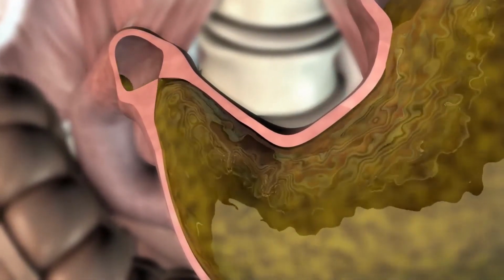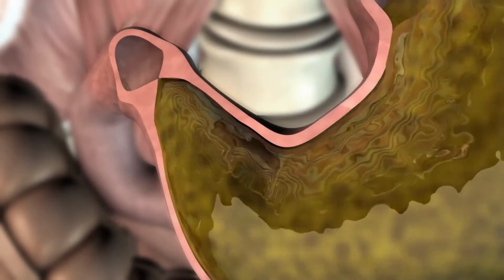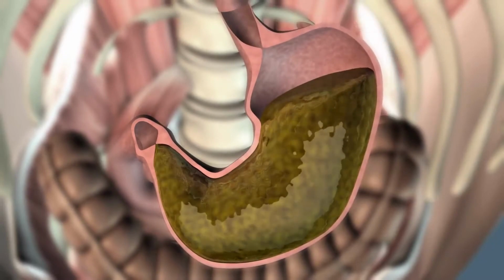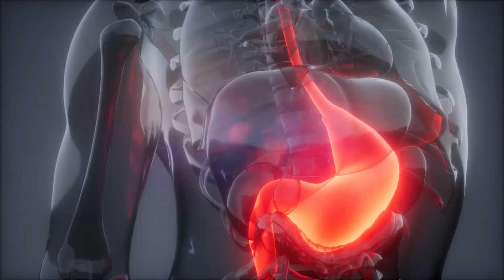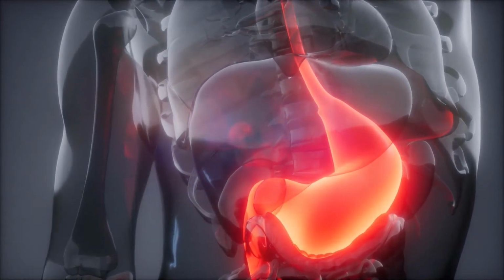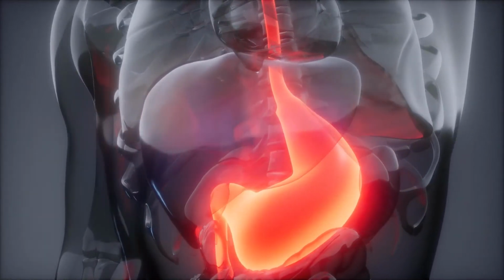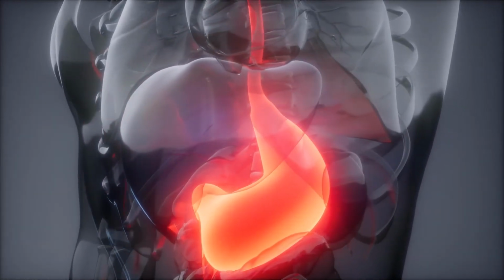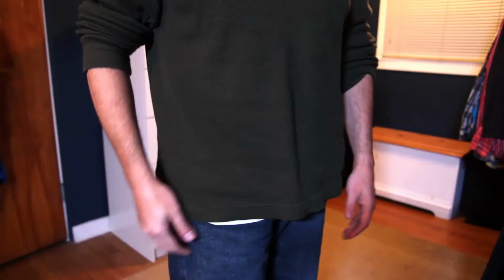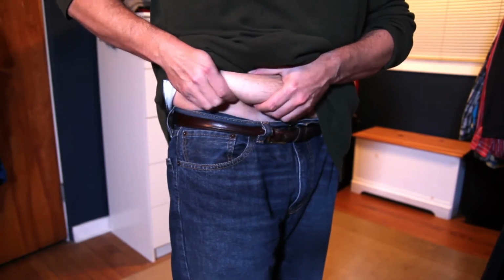Esophagogastroduodenoscopy, EGD, or an upper endoscopy, is a type of endoscopy test used to examine the stomach and esophagus. The scope is threaded through a patient's mouth down into his throat. An EGD is usually used to determine the cause of abdominal pain, vomiting, or heartburn. It can help diagnose conditions such as celiac disease, gastroesophageal reflux disease, or tumors.